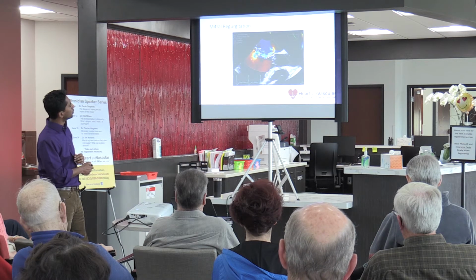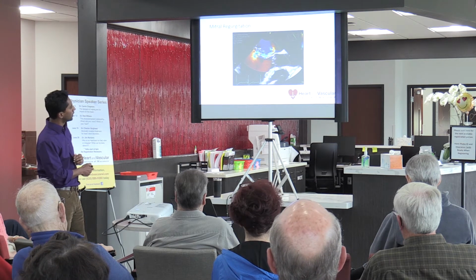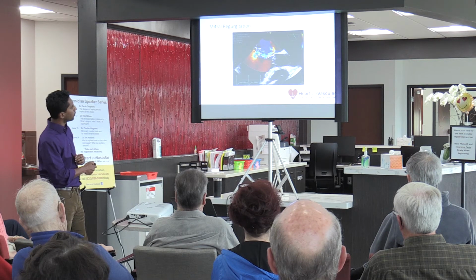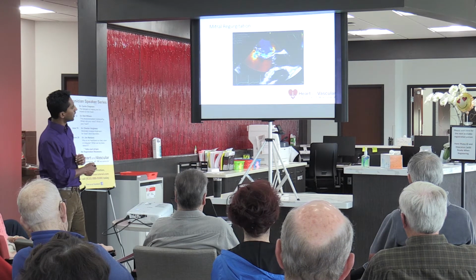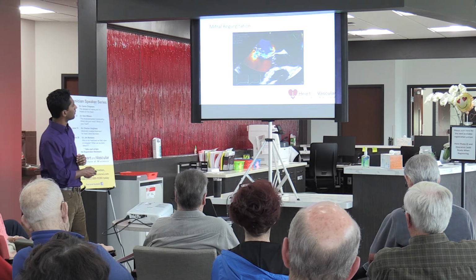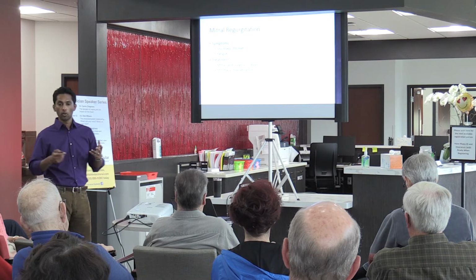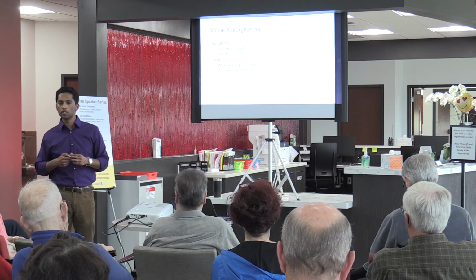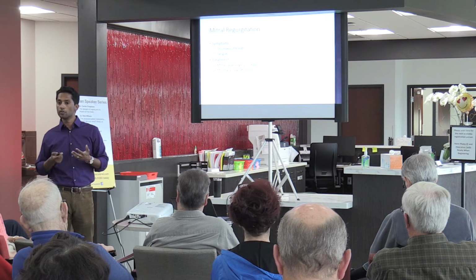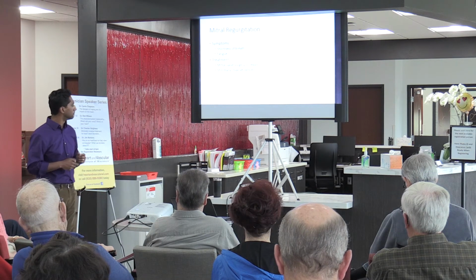This is a still frame view of what that leakiness looks like, right? Where all the blood is supposed to flow this way, this colorful jet you see coming up and around is blood leaking back from the bottom chamber of the heart on the left side through the mitral valve and up into that top left chamber. So once again, very commonly, we see folks with mitral regurgitation complaining of shortness of breath. Sometimes they can also complain of fatigue.